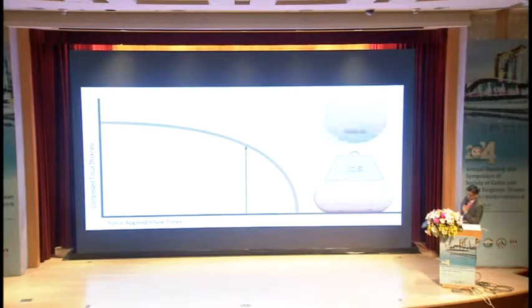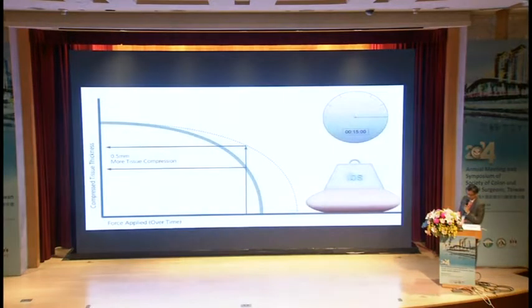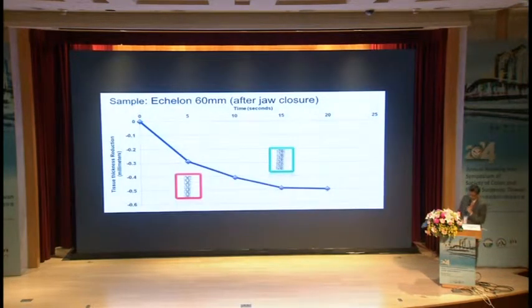In this graphic, we can find that external force is applied for 15 seconds. We can see 0.5 millimeters more tissue compressed. An Echelon study has found that the tissue thickness changed during the 15 seconds right after force is applied.